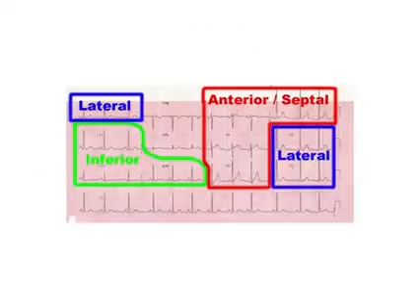You can use my mnemonics, you can do your fancy cardiology things that you try to do when you're a gunner and you impress people in medical school. But either way, as long as you know where the leads are, I'm fine with that.